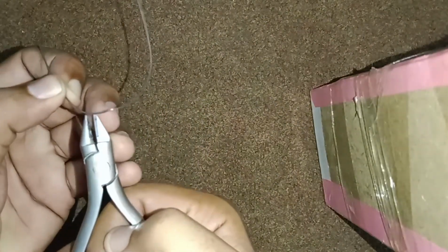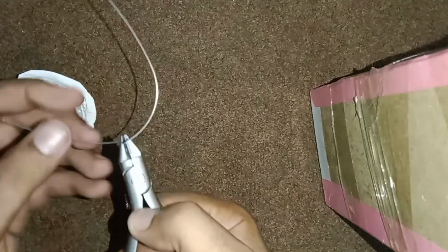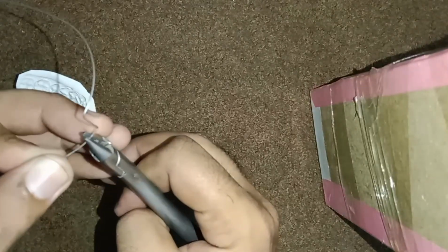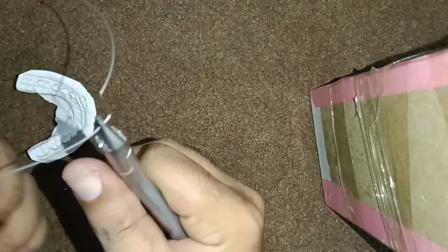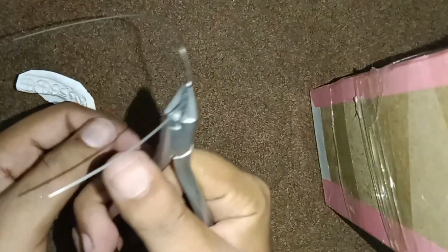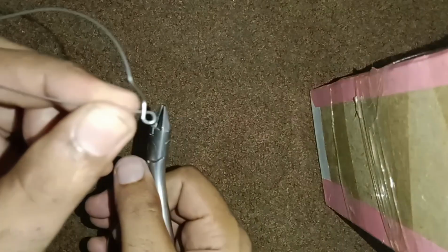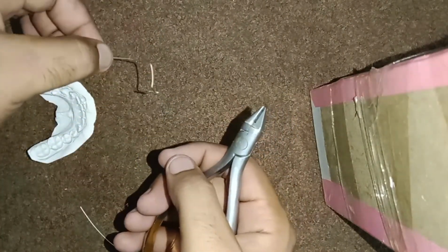Then we will hold the wire at the 6-7 mm point and give it a 90-degree bend. Then we will make a loop at this point. You can see there's a loop.